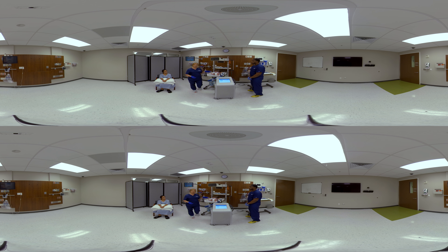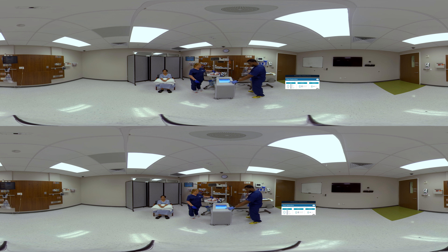You'll ensure that your device is plugged in and powered on, and then we will begin here at the therapy selection screen. We have the options of normothermia and hypothermia. For this patient, we're going to use hypothermia. We'll select that this is a new patient. Here on this screen, you can select your patient population based on the pad size that you've chosen. For this patient, we're going to select neonate.